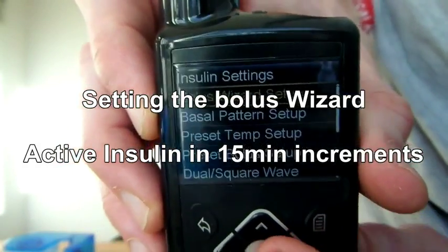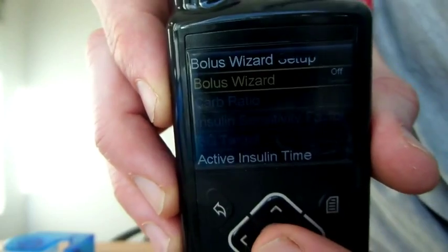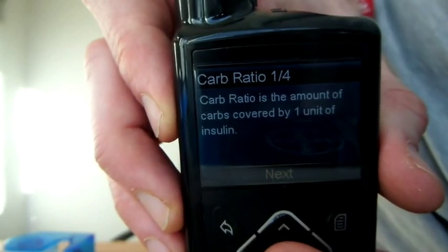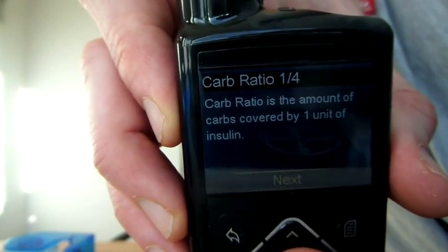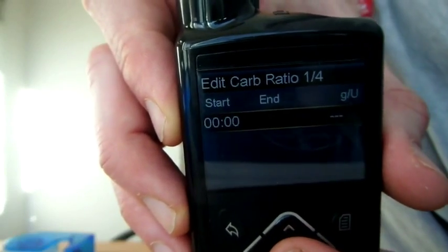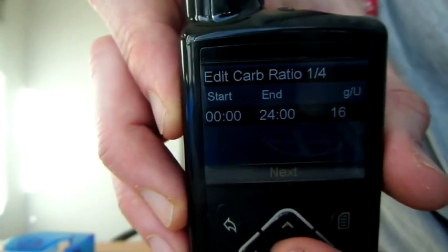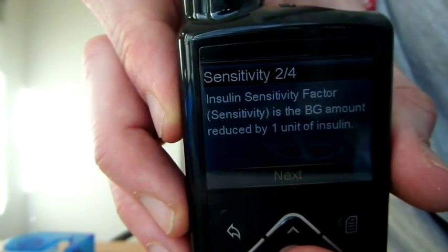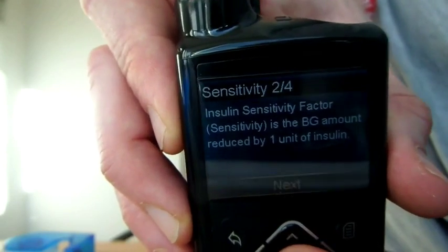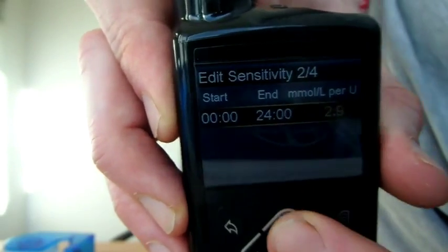Setting up the bolus wizard — pretty easy. Into the bolus wizard, turn it on. It actually talks you through for the first time what each individual thing is. Carb ratio: how much one unit covers in grams of carbs. For me, mine is one to sixteen, and that's pretty much all times of the day. Insulin sensitivity tells you how much one unit of insulin brings your blood glucose down — for me, one unit brings my blood glucose down by three.